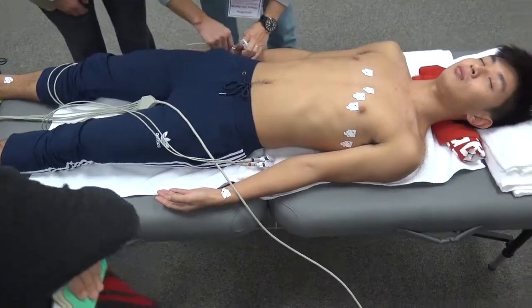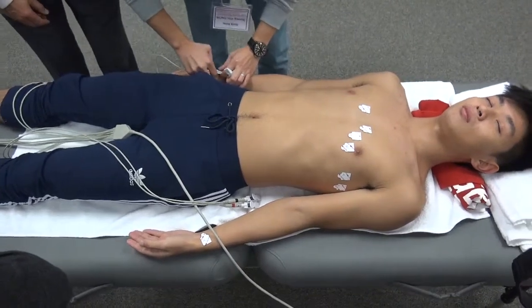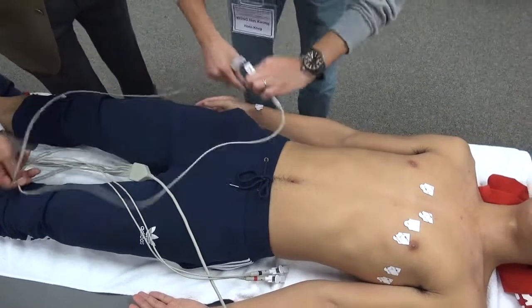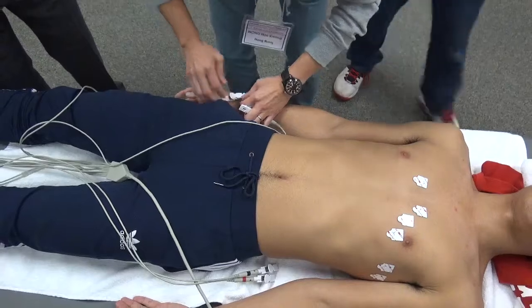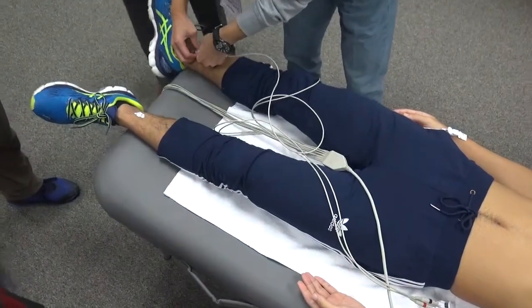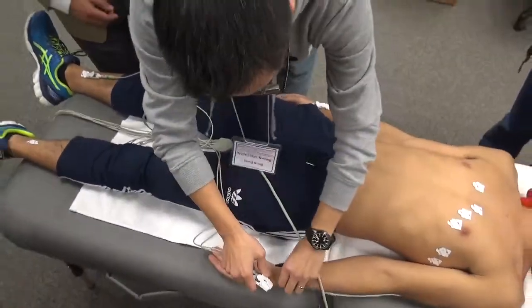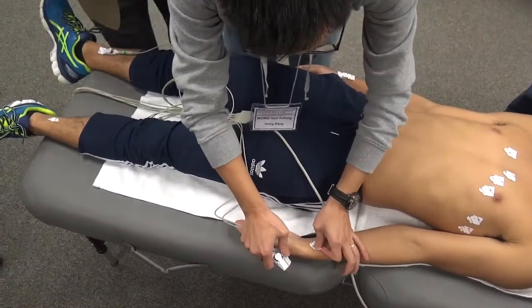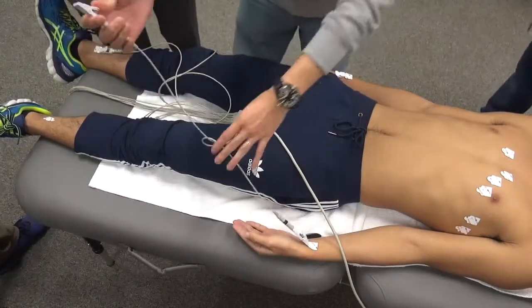So right, is that RA on that one, yeah? Yeah, RA, that's fine, yeah. There you go. Well done. So you realise there, yeah? It's all about where they're placed, and you're absolutely right that way. Now you're glad it's going upwards, aren't you? That's good, yep. Got to be careful about taking things on and off too often because it loses the stickiness. That's it.